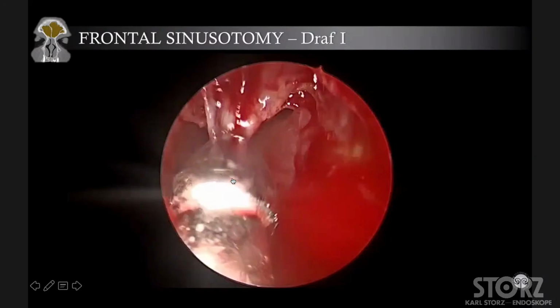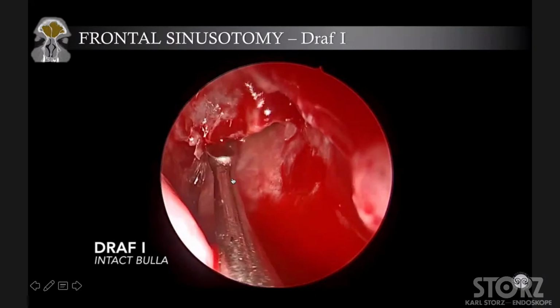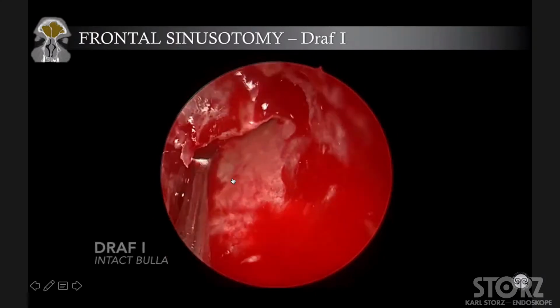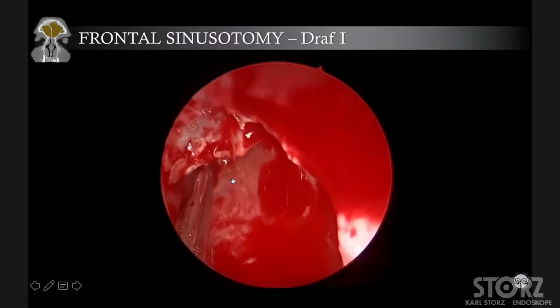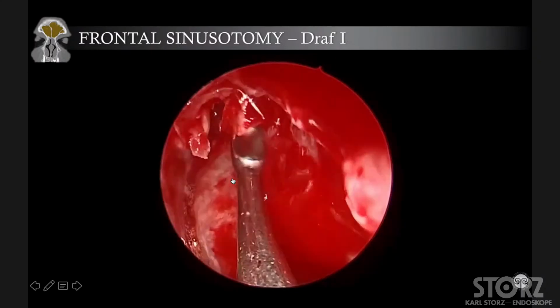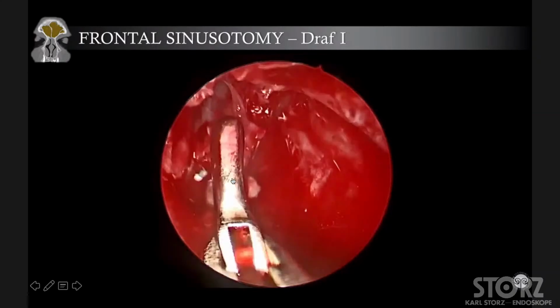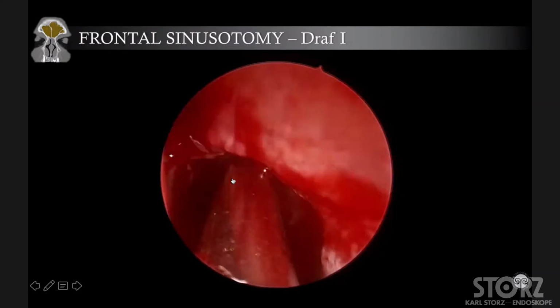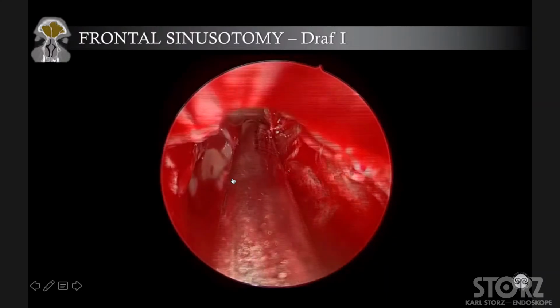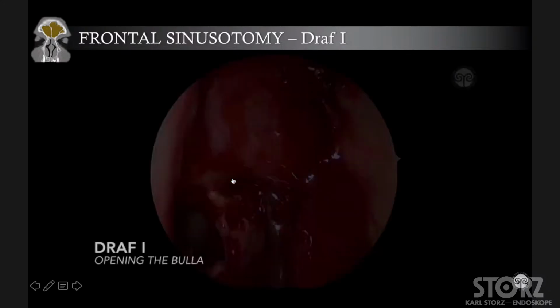Now I show you some anatomical video from live surgery, only to show you that sometimes live surgery is much more difficult because the patient is bleeding, and so it's not so easy to understand all the anatomical structures I have shown you before. So we are cutting the vertical portion of the uncinate process. Once the vertical process of the uncinate has been cut, we can identify the frontal sinus.